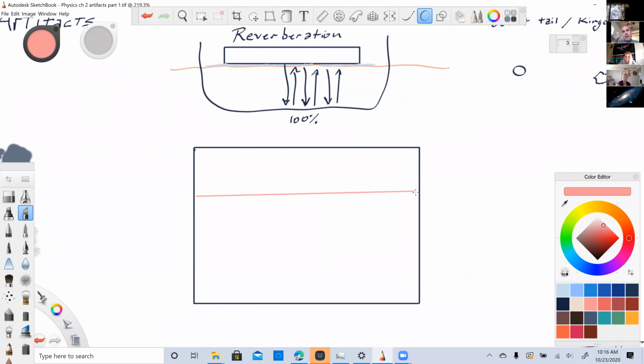The first line represented the true echo, the true reflector, the bottom of the Tupperware. But then we would see another line. And if we had it deep enough, we would see yet another line.